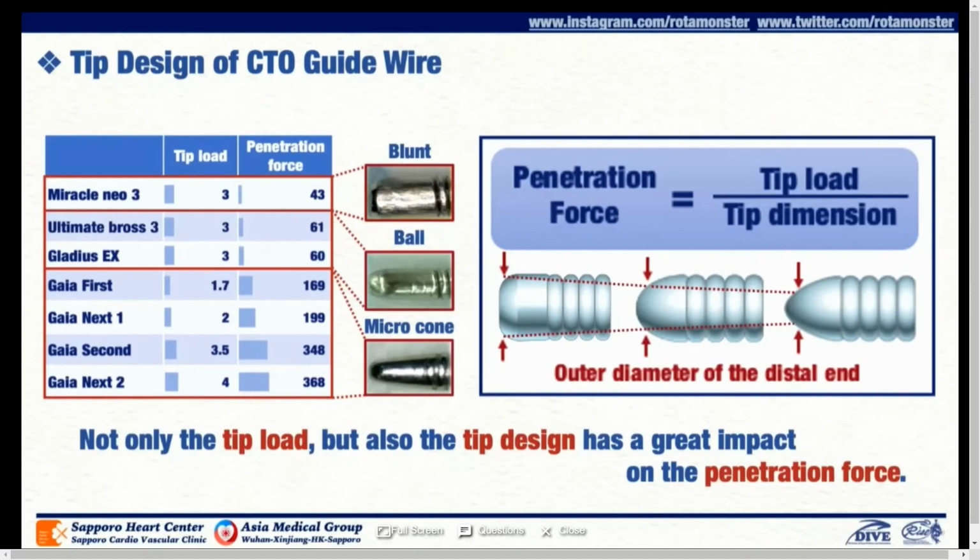This may be due to the fact that the guide wire itself is extremely thin, making it difficult to notice the difference in the tip design. So I will show you a magnified view of the guide wire tip to make it easier to understand for you. Then you may notice that there are very different tip designs.